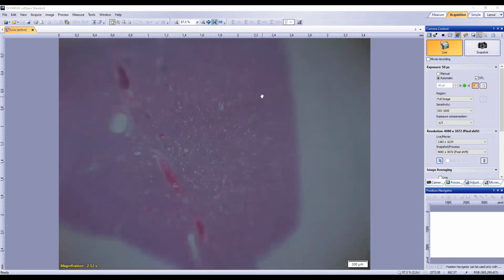Quite probably bronchointerstitial pneumonia, but we don't have a pleuropneumonia, and there's another feature that we don't have. Diffuse alveolar damage is one of our differentials for a diffuse process like this. There's a particular feature about the interstitium that we don't have in this that is going to direct us away from particular types of pneumonia and toward others.